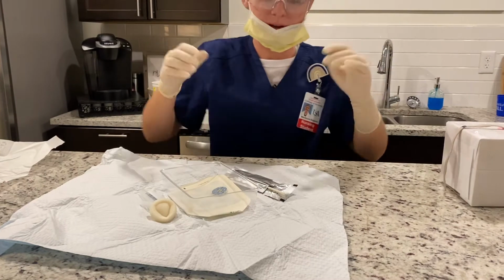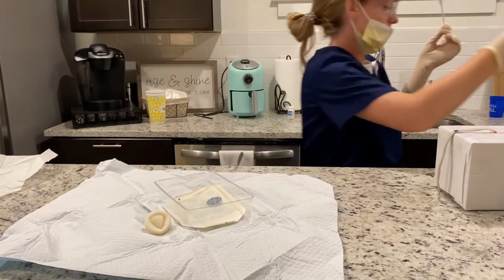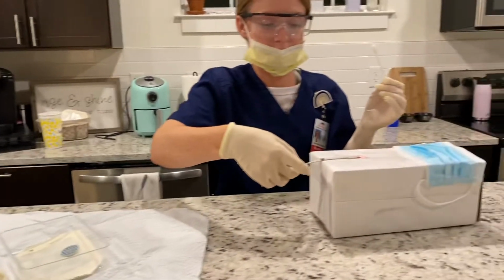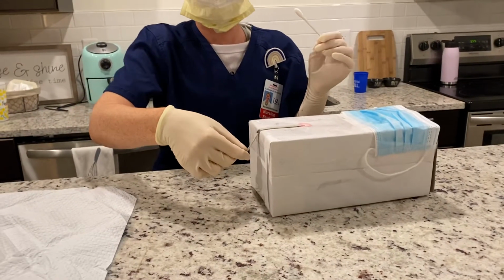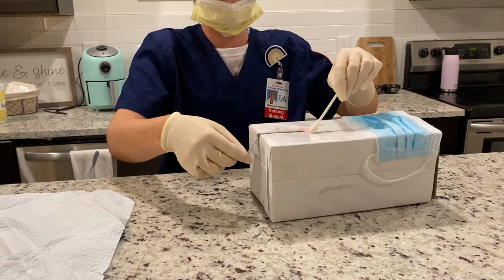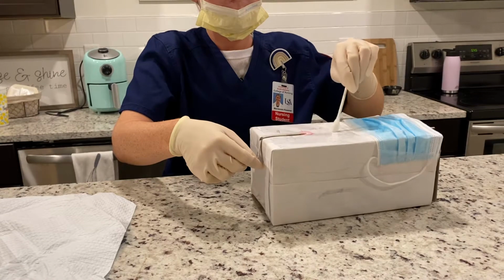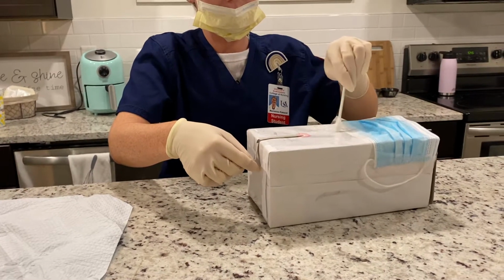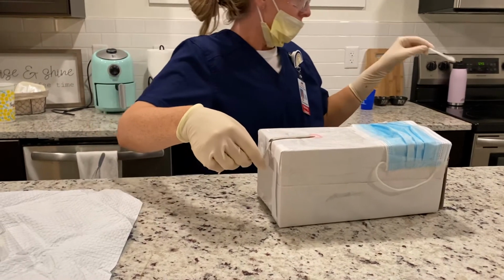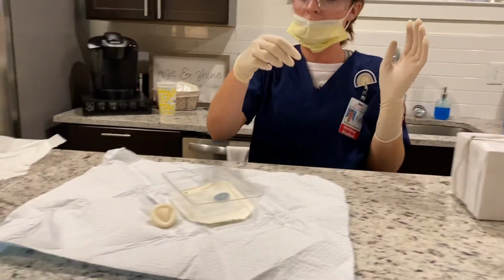I'm going to now open up my alcohol swab and dispose of this. So with this hand, I'm going to secure the catheter. So now this hand is contaminated, and I'm going to start at the insertion site and go outward in rainbow motions, cleaning the surrounding skin. And now I'm going to dispose of the waste.